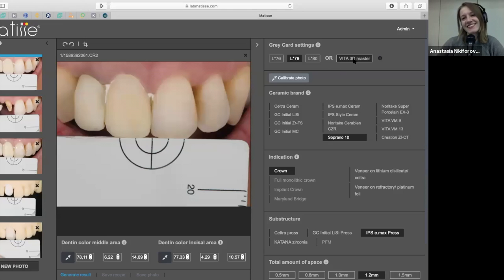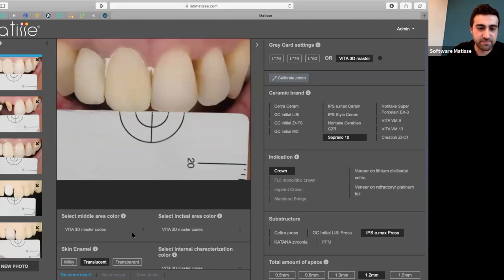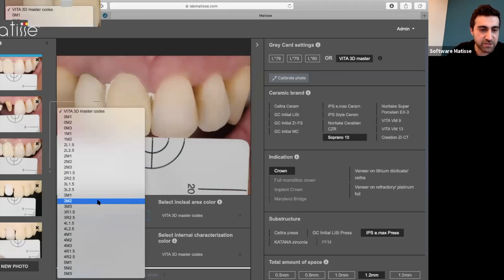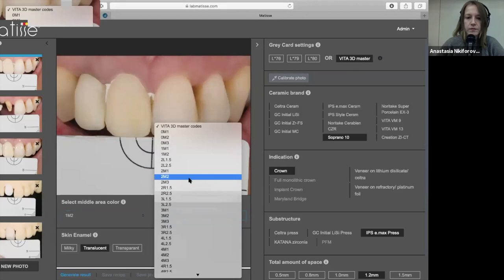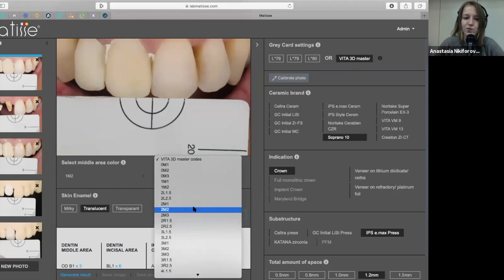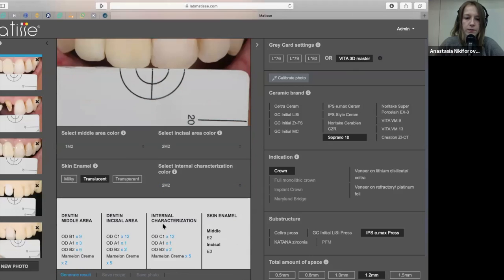So you go here to Vita 3D Master. Select Vita 3D Master here. You will see that these colors change to Vita 3D Master, and the digital coding changes immediately. Then you select your Vita 3D Master color here, the shade you need. And you generate the result.